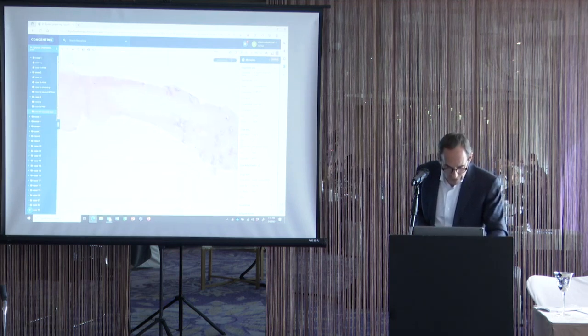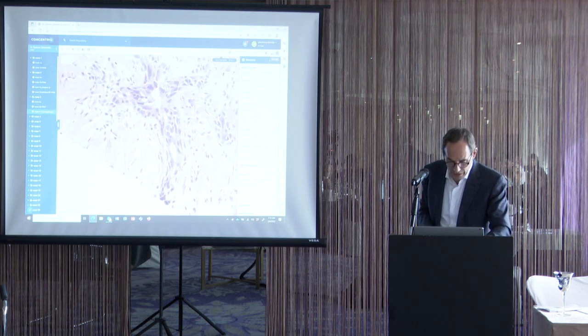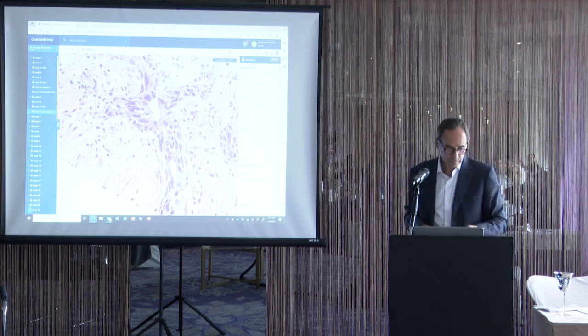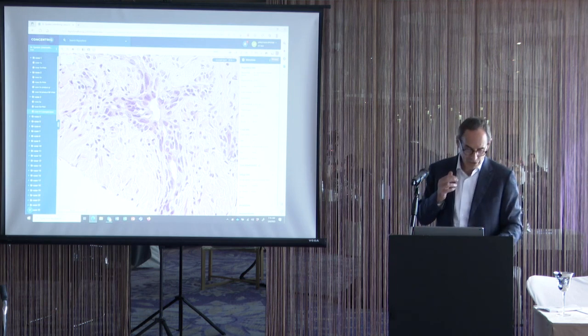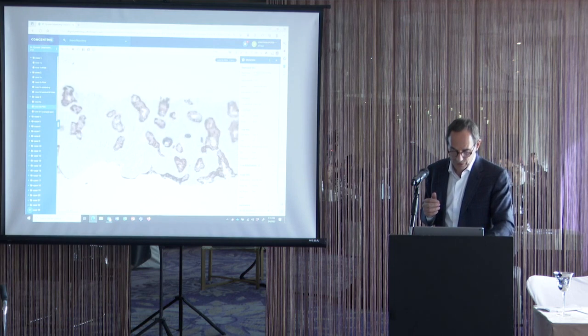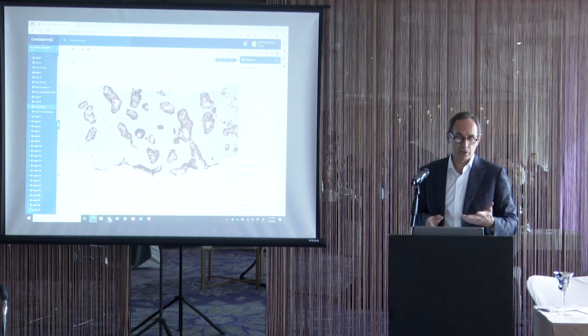Again, atrophic glands. Let me just see if I can find a situation with kind of more streamy cytoplasm. The other thing that you often see with radiated benign glands is that the nuclei often stream. Here we see a little bit. They almost look like they're streaming kind of parallel to the basement membrane. That's classic for benign prostate tissue with radiation effect as well. If you stain up benign prostate tissue with radiation effect, it'll light up with high molecular weight cytokeratin. So it becomes very straightforward if just doing the basal cell markers.